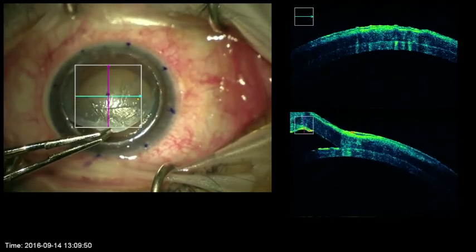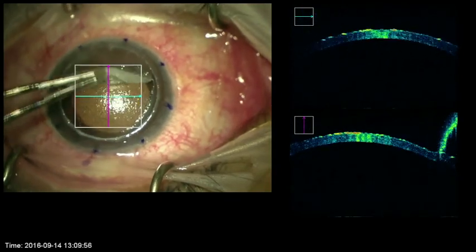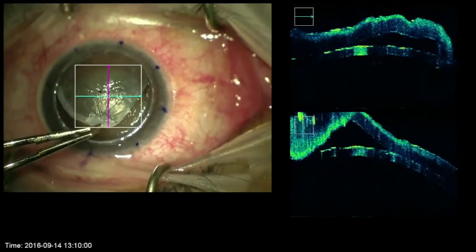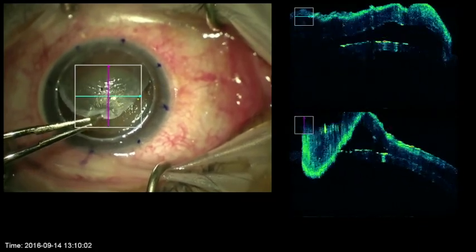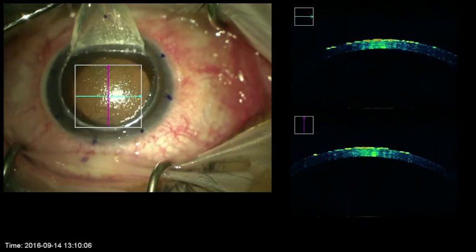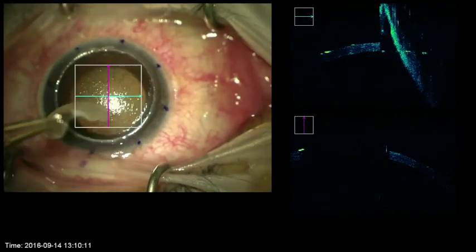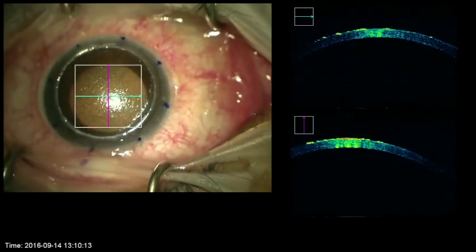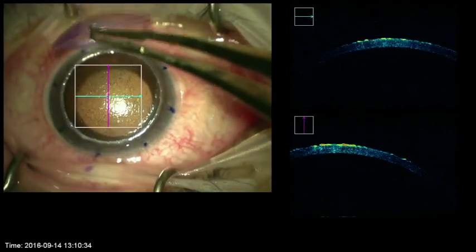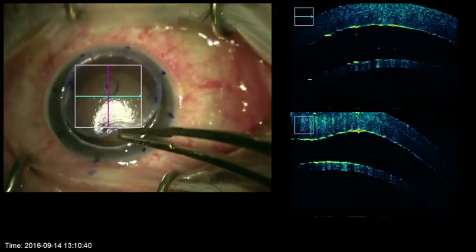This also shows how smooth and clear the recipient stromal bed has remained three months out from the grip and rip technique. The original dissection in this particular case left an approximate 200 micron recipient bed. The new donor was lightly put in place and the OCT clearly shows the anterior and posterior layers along with the interface.